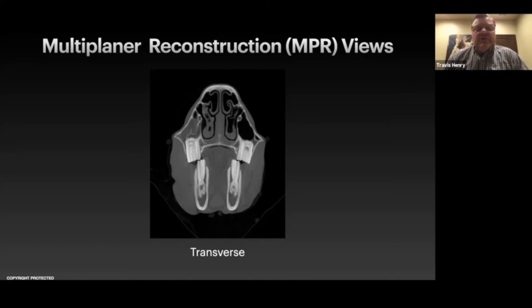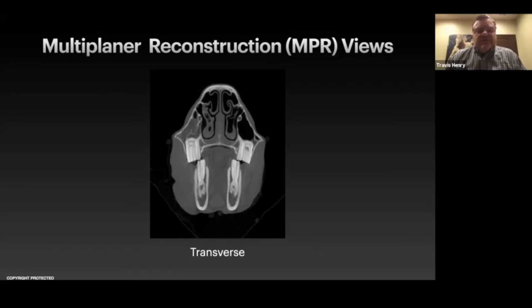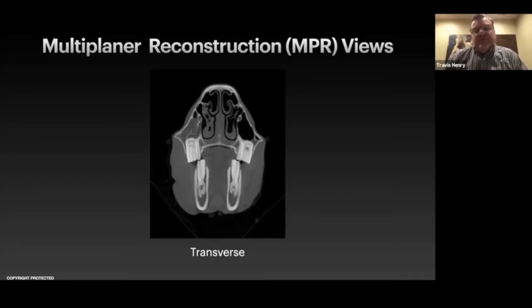When you put the horse in the CT scanner standing, sometimes they're a little crooked — they're well sedated and not moving, but not positioned exactly straight. That can create problems when you're looking at just the native images. We're going to talk about multi-planar reconstructions because we can compensate for that and straighten them out.